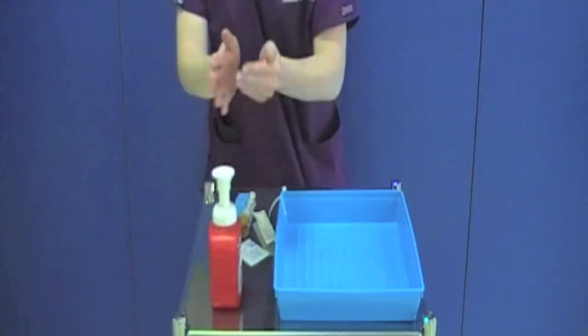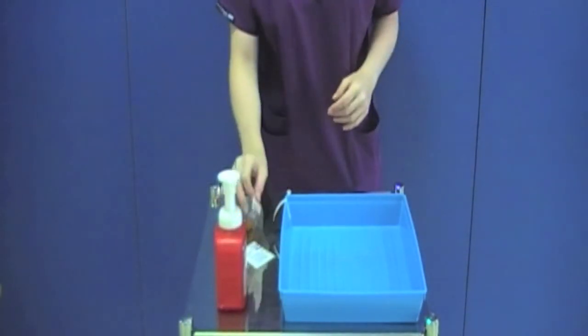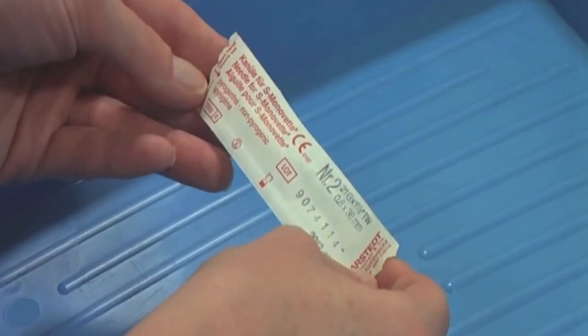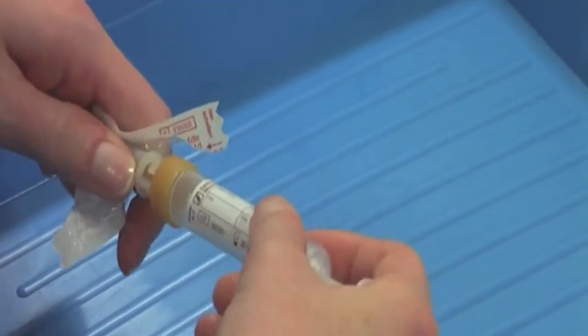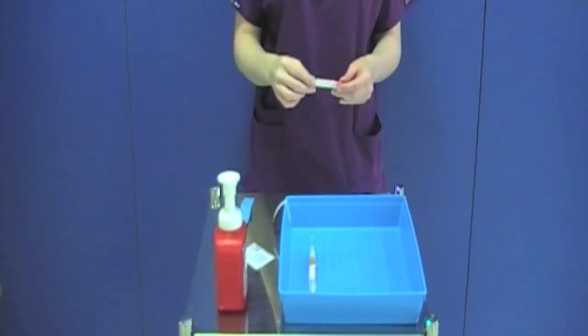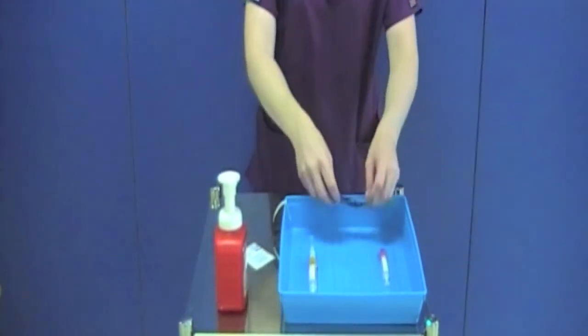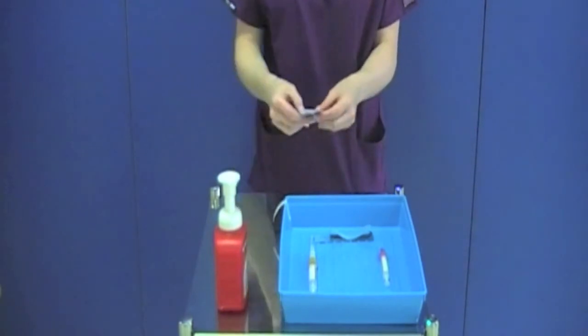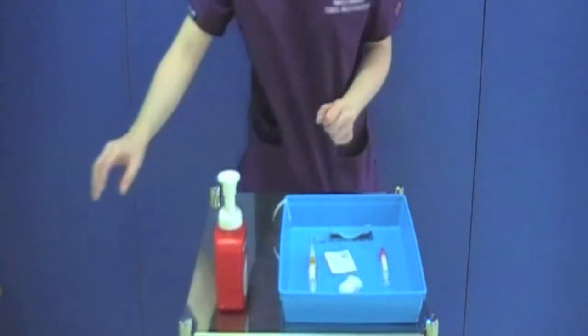You must now decontaminate your hands. Check that all of your equipment is in date. Remove the needle from its outer packaging and attach it to the first blood sample bottle. As the key parts are still protected, you can place the bottle and the needle into your tray along with the rest of your equipment. Place your apron and gloves onto the clean trolley.